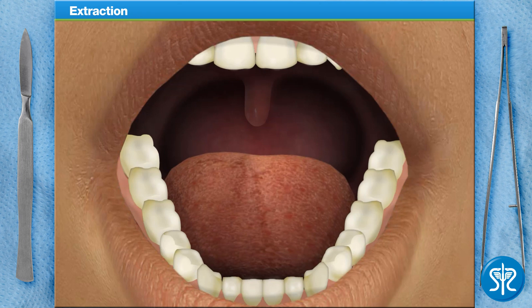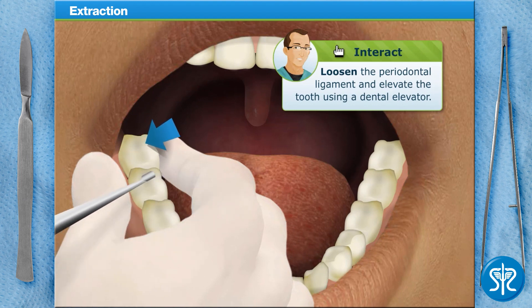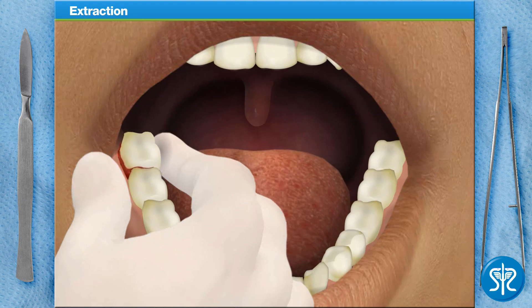First, you'll need to loosen the periodontal ligament and elevate the tooth using a dental elevator. Using the dental forceps, grip and rotate the tooth in a clockwise rocking motion until it's loosened and removed.